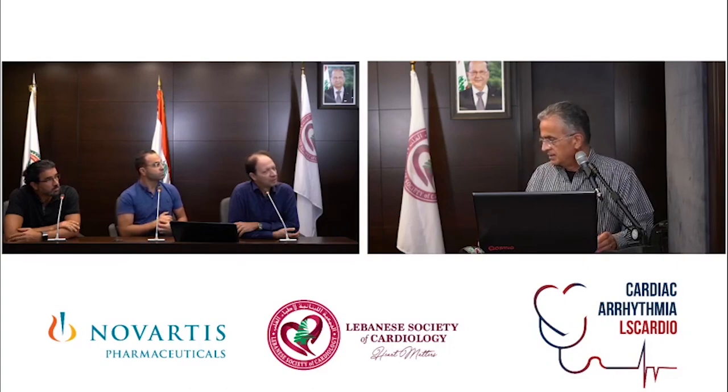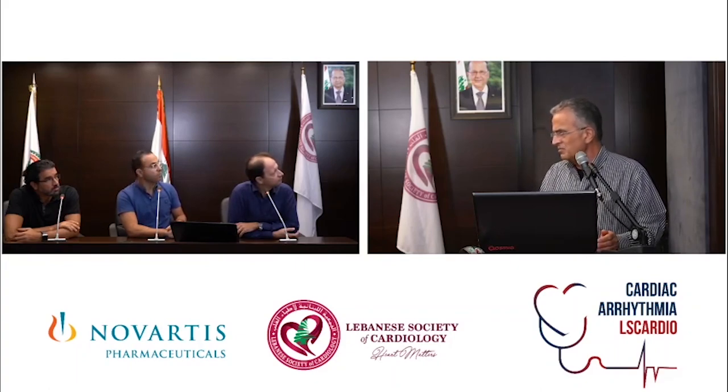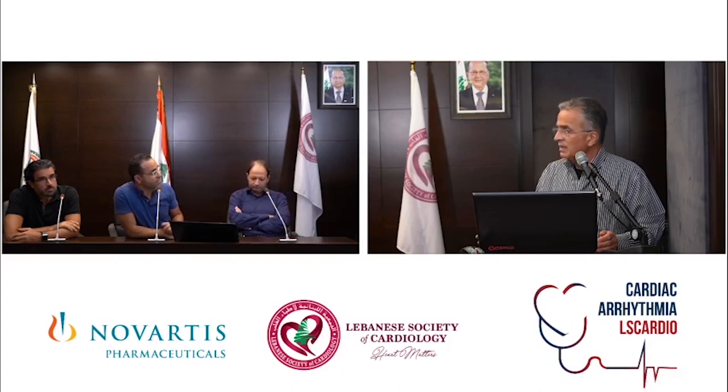And how often do you send your patient for optimization of AV or VV delay? Now, with the new machines, all the companies we use have an automatic system, which is acceptable. Doing an echo is really time-consuming and does not work most of the time. What's the role of echo before and after CRT? We hear this frequently.